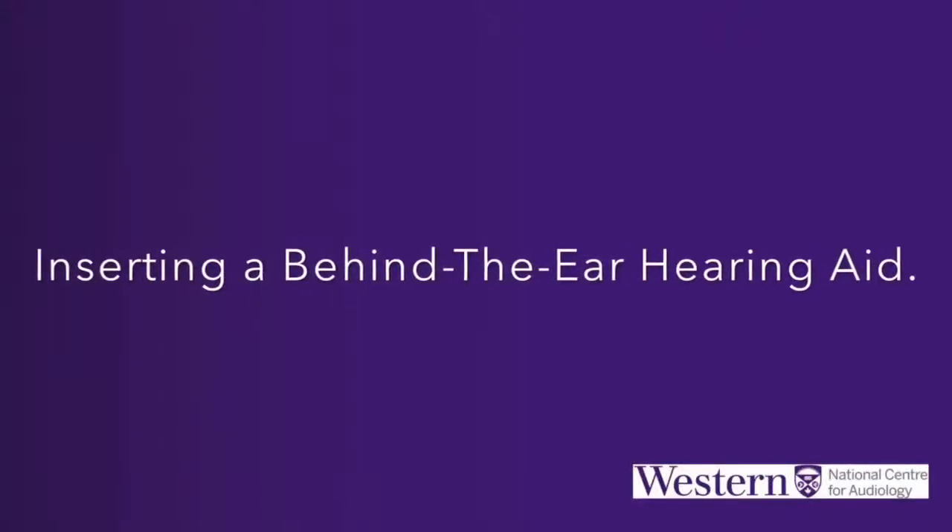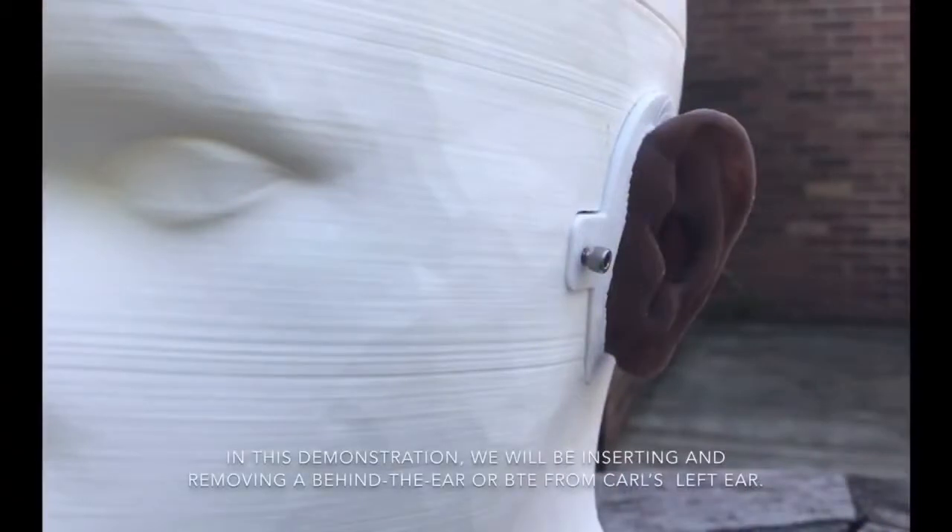In this demonstration we will be inserting and removing a Behind the Ear, or BTE, hearing aid from Karl's left ear.